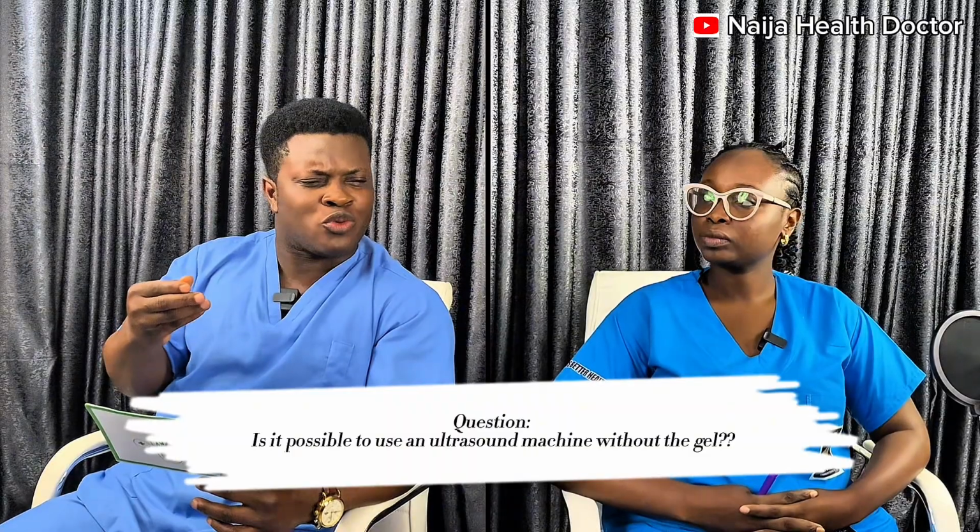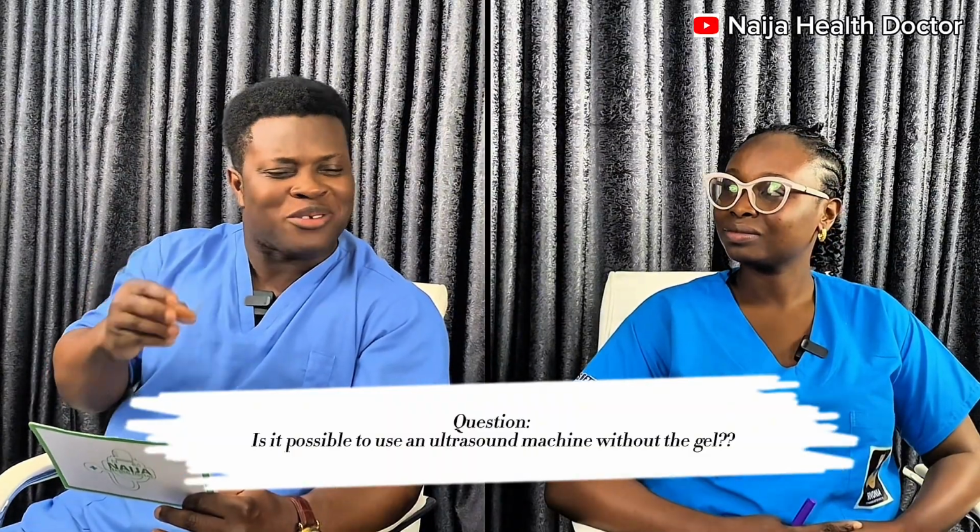No, I want 3D, I want 4D, I want this D. Is it possible for someone to use the ultrasound machine without using the gel? You won't get a clearer image while doing that.